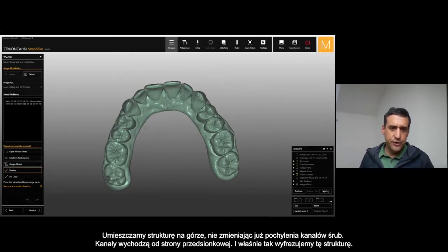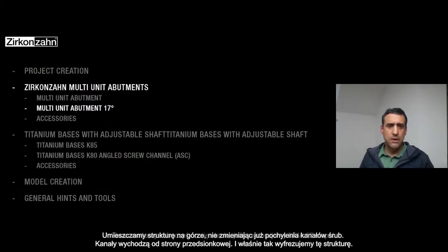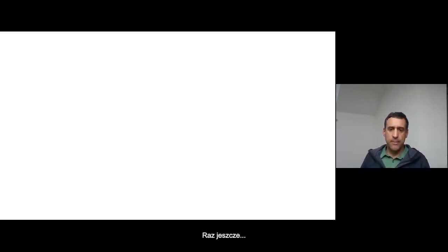You can see that if I go straight without moving the inclination of the channel screw, I have the channel screw coming out vestibularly.